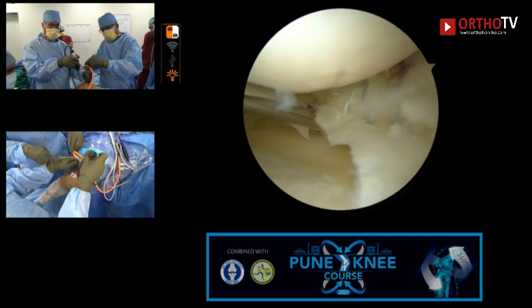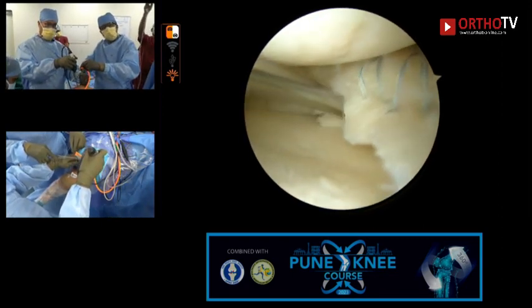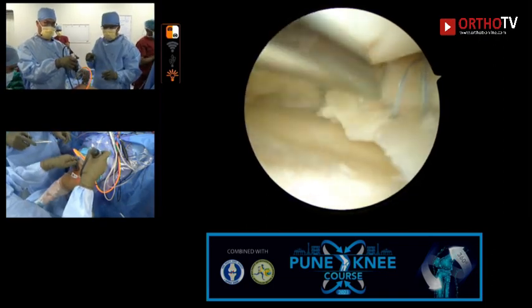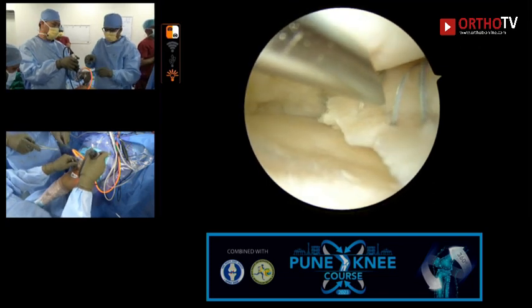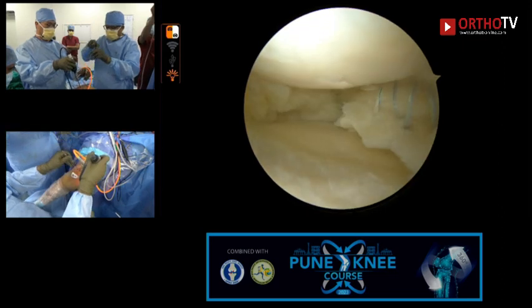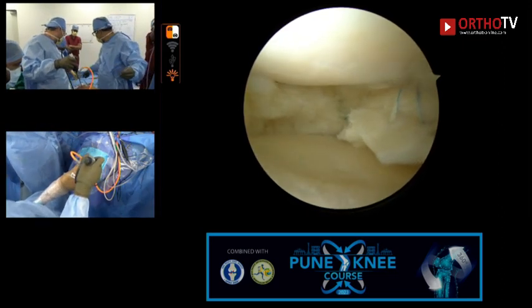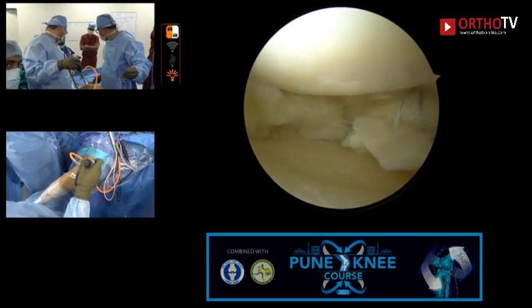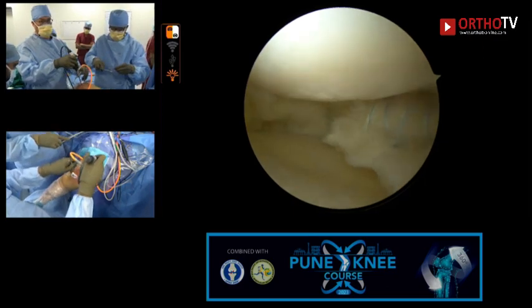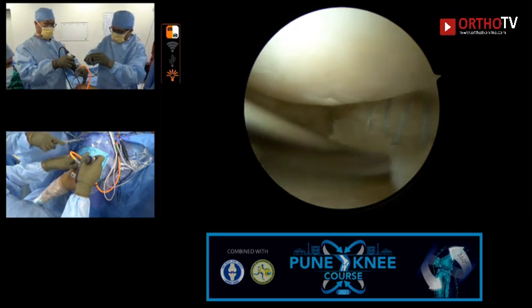So it's almost a lost art, out-to-in suturing. It's amazing, really, how we've embraced all-inside devices at huge cost, and as I said, with inferior results. So I think particularly if you operate on athletes, you'll find out if an operation works or not because they really test it. Whereas I suspect with all-inside devices, there are a lot of unhealed repairs, but we just don't notice because the patients don't do enough to cause symptoms. And we all think we've done a great job, which I guess we have, but we don't realize we've failed.